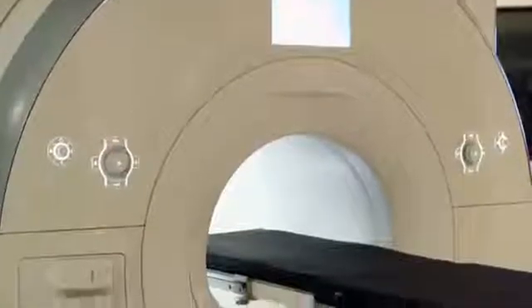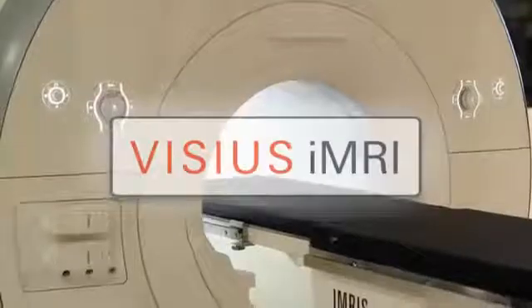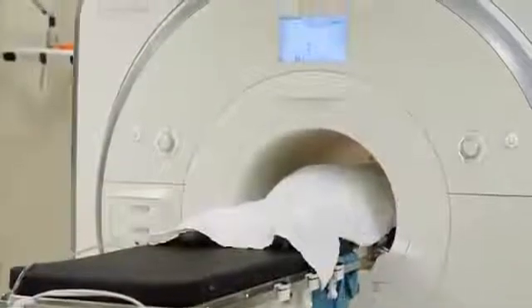So it's very exciting. The benefit to an individual patient actually could be being able to have an operation that they may not otherwise be able to have without the technology. In particular, for brain tumors or spine tumors, certain types of conditions may not be safely treated without reliably imaging things during the operation to guide the surgery. So it would certainly benefit those patients.